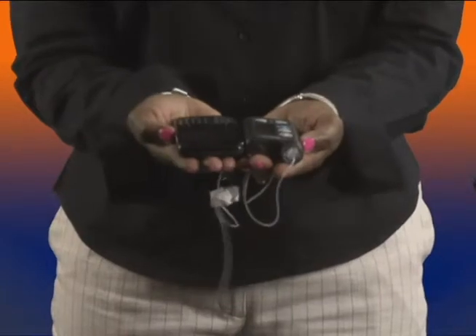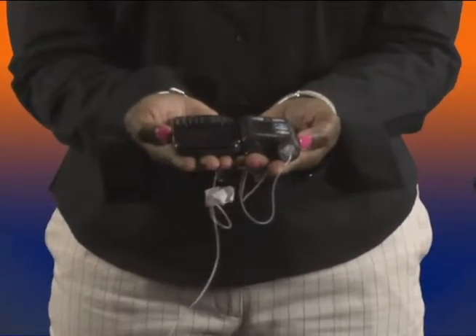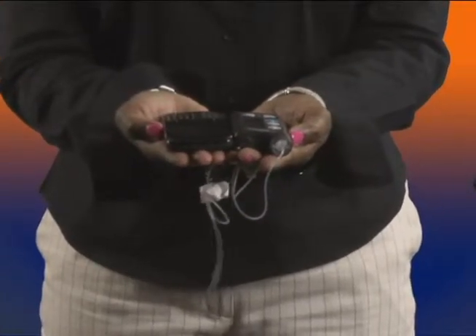The first thing I want to show you is the size of the pump in comparison to my Blackberry, and you can see that the pump is a little smaller than my Blackberry.